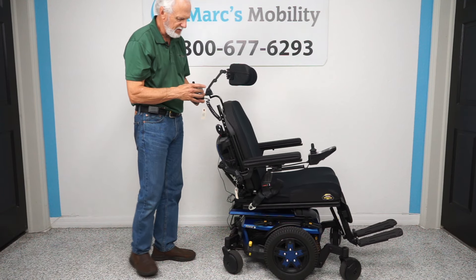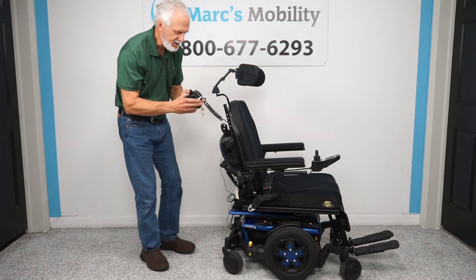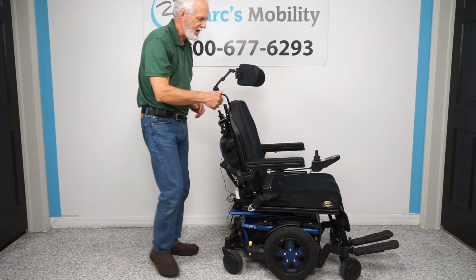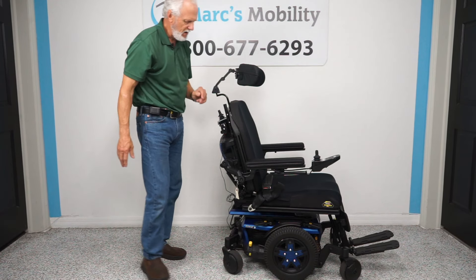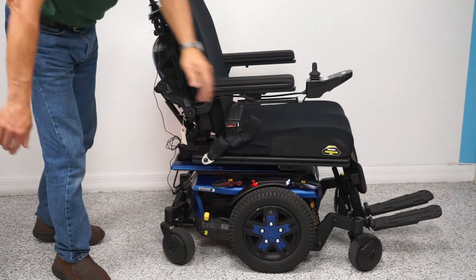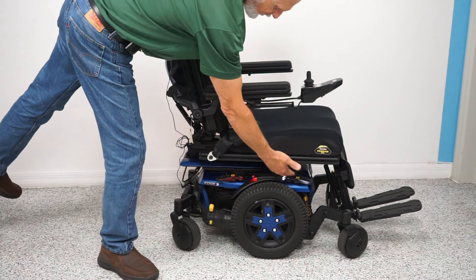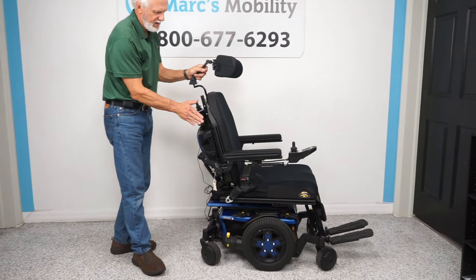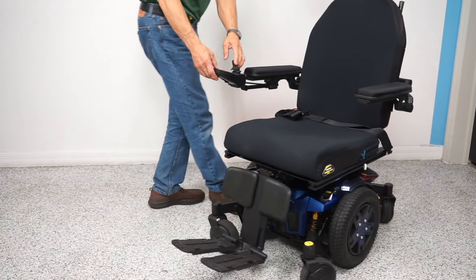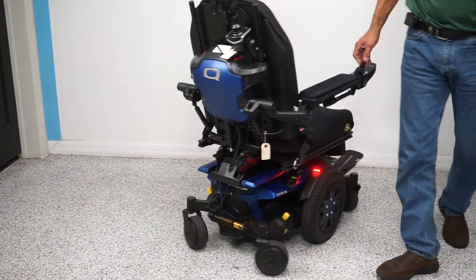I can also tilt the seat back from the attendant control — you can see the seat going back — and do everything from here that you can do with the main joystick, while walking behind the chair with your loved one. That's called the attendant control. Right here is the light switch; there are lights on the back and front of the chair, headlights and tail lights.